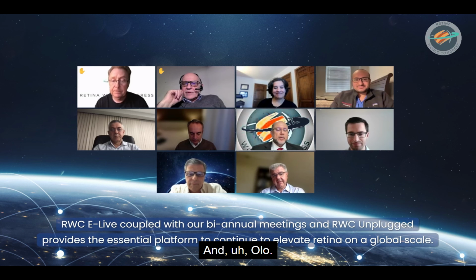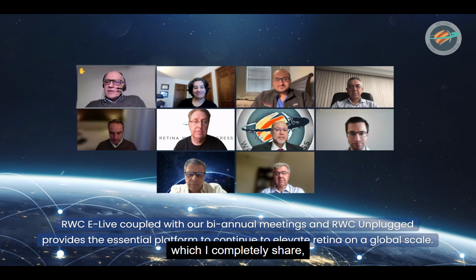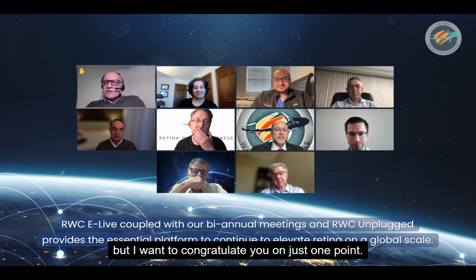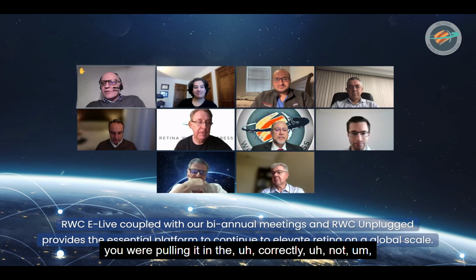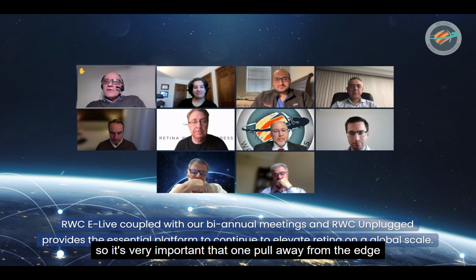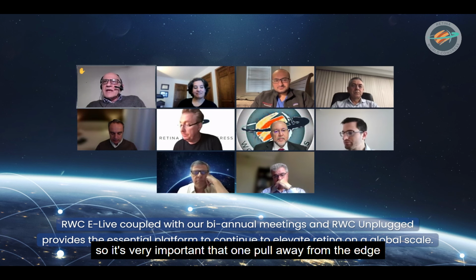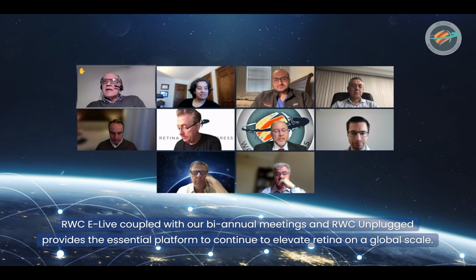And Gianpaolo. So everybody is giving you good suggestions, which I completely share, but I want to congratulate you on just one point. When you were actually removing that membrane, you were pulling it in the correct direction, so as not to enlarge the hole. So it's very important that one pulls away from the edge of the retinectomy that you've made.